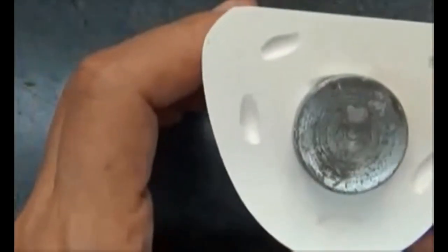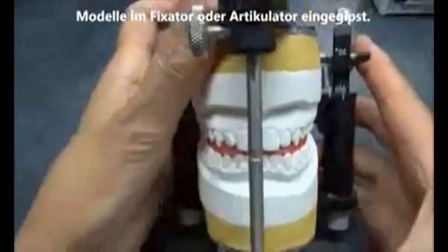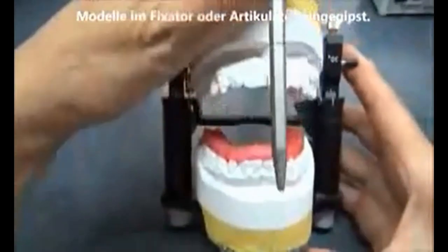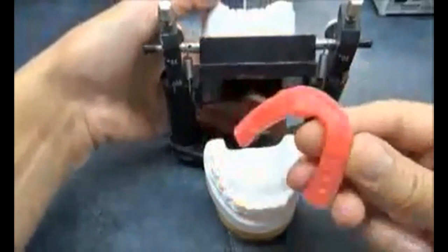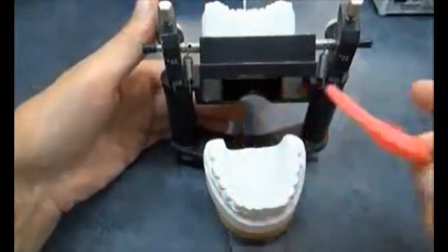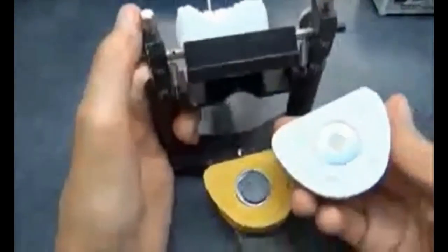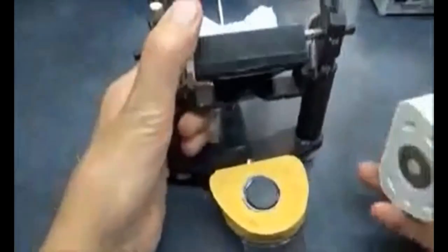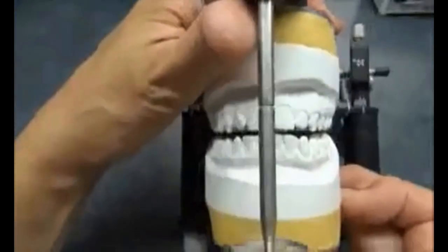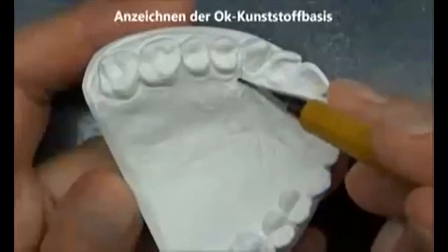This is according to your functional matrix theory. So we alter the functional mandible, forcefully make the patient bite in a forward position repeatedly, and then we can discard this bite and just make the appliance and give it to the patient. So with time, your condyle, bone, everything will adapt since the patient is growing. Okay, remember we are giving this in growing patients. If it is a skeletal problem in non-growing patients, then the only option will be a surgical line of treatment.